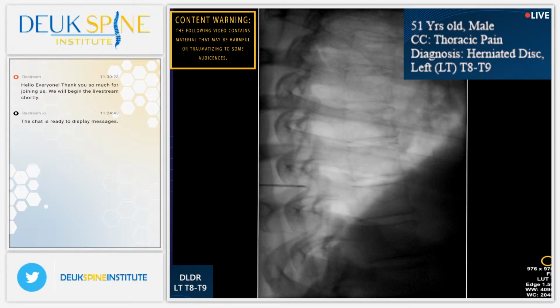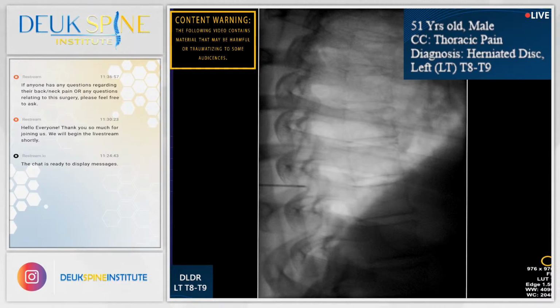If you have questions, feel free to type them up. I'll do my best to answer. Let's try to get those pedicles lined up. You see right in front of the needle there, Jordan? Those pedicles are off on orbit, and they're also off on WAG. How are we doing on arm boards? Arm boards are far enough north? Yeah.